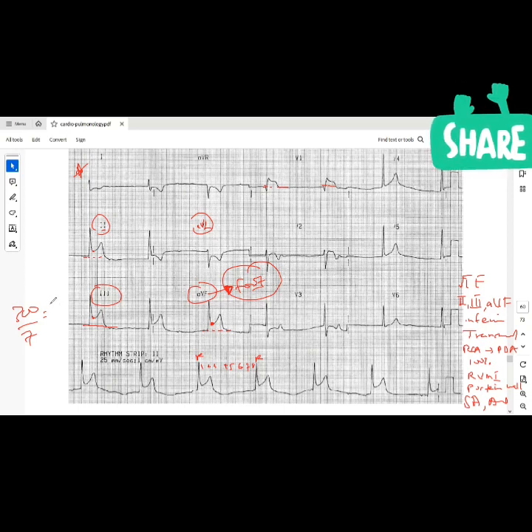You can use a calculator. I don't have a calculator here. Let's go, doc. Sharp, sharp. 42. Hmm? 42. What is that? Is that normal?